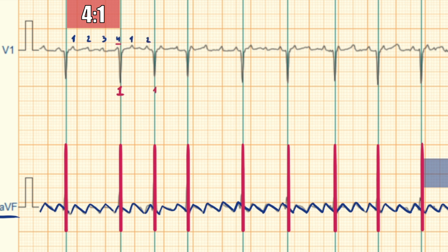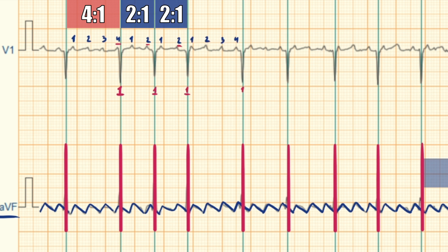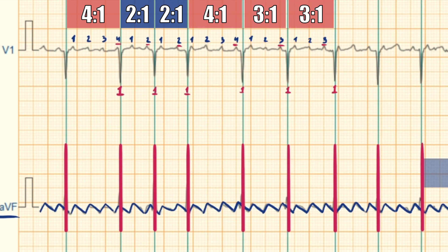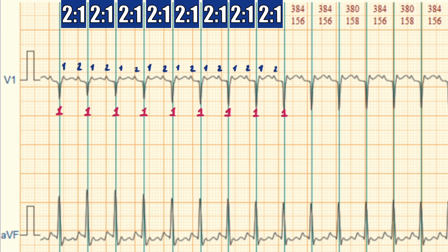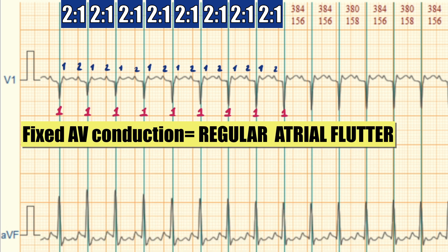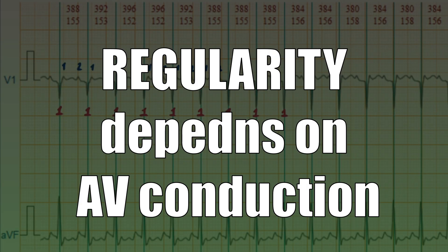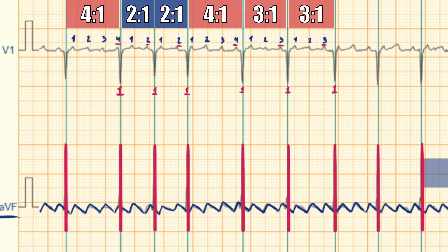In the next segment, 2 flutter waves and 1 QRS complex gives conduction of 2 to 1. But if AV conduction is fixed — like in this ECG example with AV conduction 2 to 1 — atrial flutter is regular. So regularity depends on AV conduction, and variability of conduction through the AV node creates irregularity.